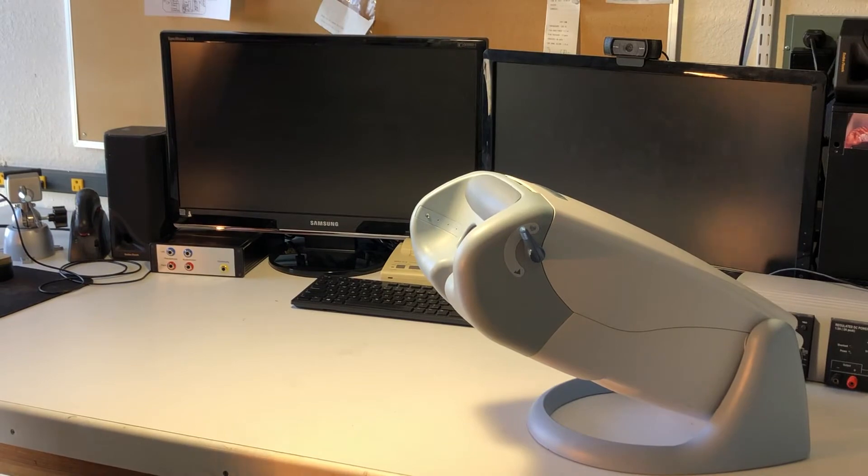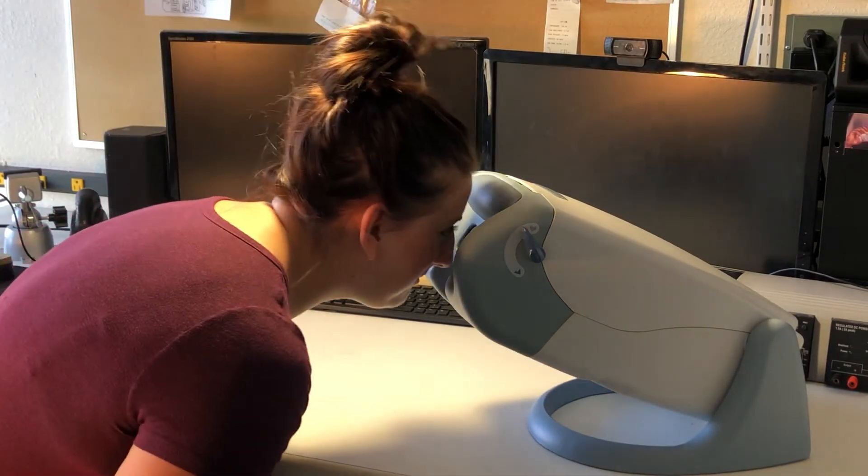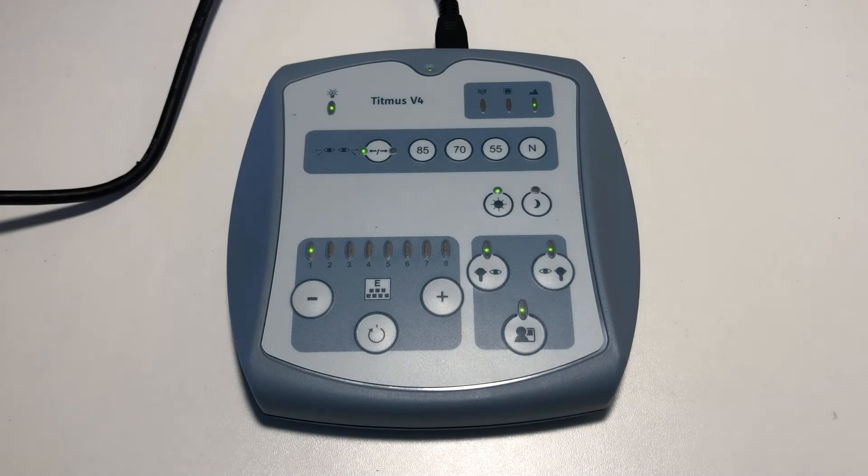Have the patient look into the Vision Screener. You will know they are in the correct position when the lights on the bottom right of the control panel light up. Note the light on the left, indicating that the Vision Screener is displaying slide number 1.